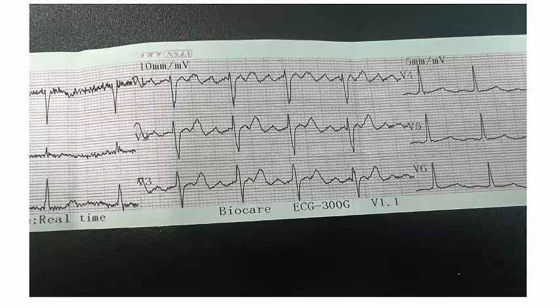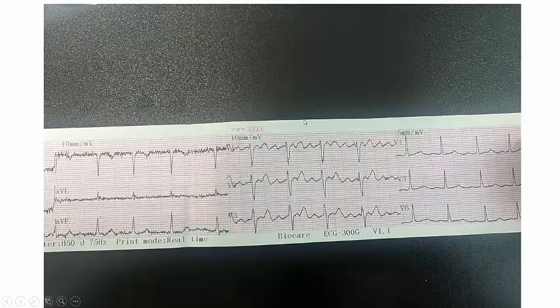In all guidelines, the American Society of Echocardiography and European Association of Cardiovascular Imaging 2016 guidelines, and the recent British 2024 diastolic function guidelines, all stress you cannot use the E over A ratio in a patient with atrial arrhythmia or reverted from atrial flutter, because of stunning of the atrial muscles and very poor contractions, so you will expect to see a very low A wave and a high E over A ratio.